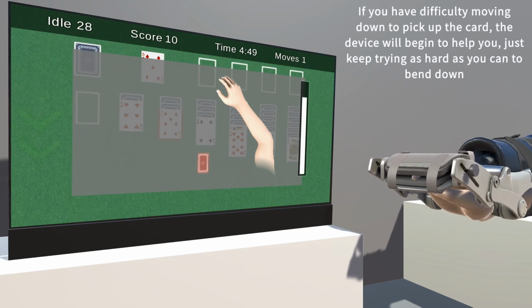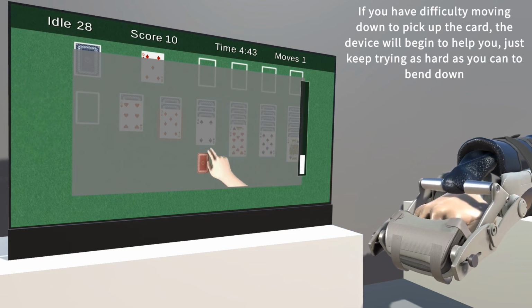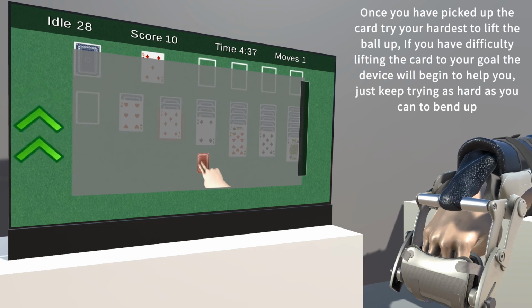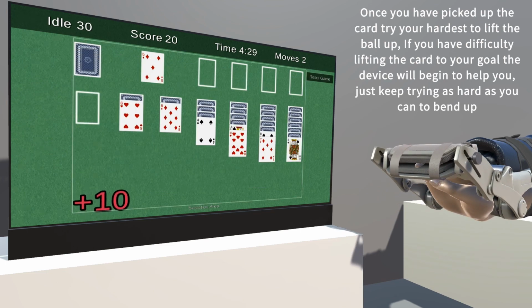If you have difficulty moving down to pick up the card, the device will begin to help you. Just keep trying as hard as you can to bend your wrist down into flexion to grab the card. Once you've picked up the card, try your hardest to lift up. If you're still having difficulty at this point, don't worry, the device will begin to step in and help. Just continue to try as hard as you can.